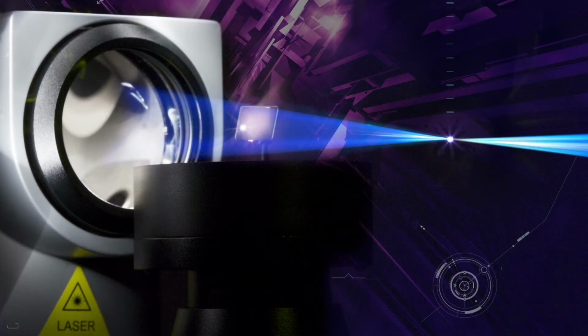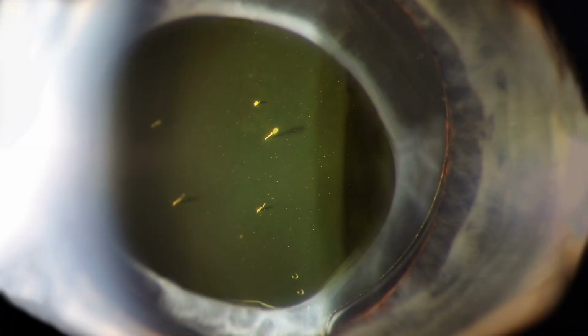Another fundamental source of error is performing the treatment without a contact lens. The YAG beam is delivered at a convergence angle of 16 degrees from the laser aperture, which should be further focused through an Abraham contact lens. If not, we do not concentrate the energy at an optimal focal point but rather in a broad focus. These two pictures show quite impressively how this entire IOL is practically pierced right through.